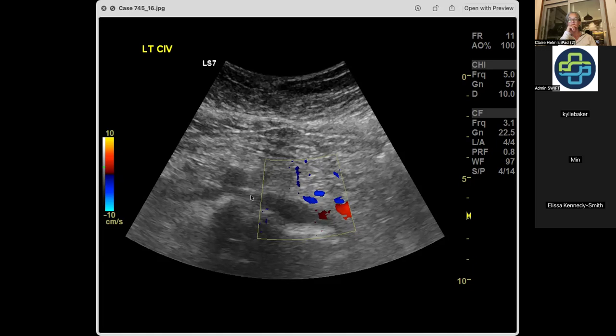She then got a CT venogram, which showed an isolated segment of thrombus sitting in her iliac. And the thought was, because there was nothing else, the rest of her abdominopelvic CT was normal, that probably this had been sitting in her leg and then had dislodged and was currently sitting in her left iliac vein, where it had embolized to.